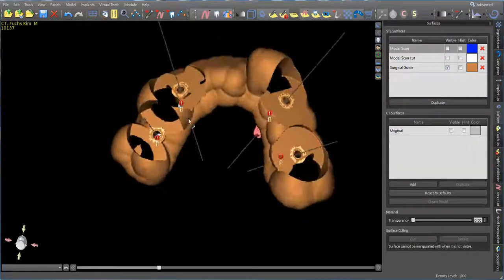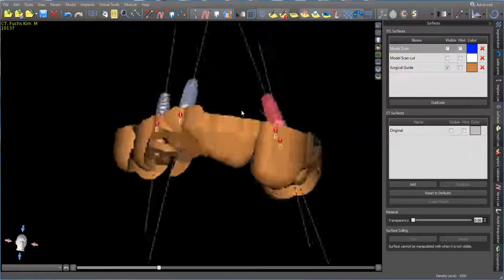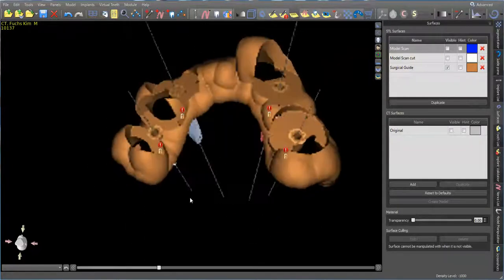We have 4 hard stops, not resting on soft tissue. I prefer hard stops, and all I have to do is 3D print this. That's it. I'll save our data and then export this as an STL file.